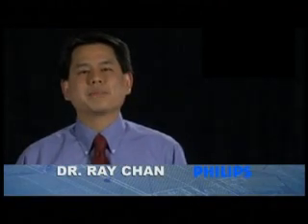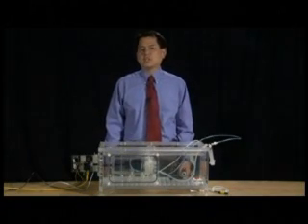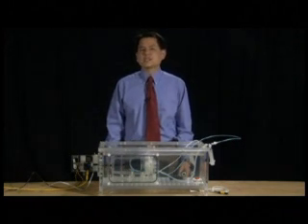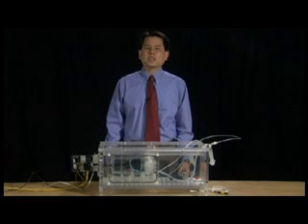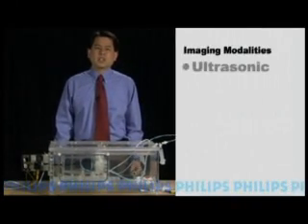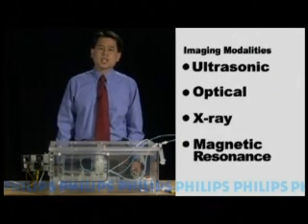I'm Dr. Ray Chan, one of the scientists at Philips Research North America. I've been working with multimodality cardiovascular imaging for over 15 years, both in academia and industry. Time and again in our research projects on the development of either new image acquisition techniques or novel processing methods, we've run into the need for versatile imaging targets that can be used reliably and reproducibly to mimic biological organ behavior under ultrasonic, optical, X-ray, and magnetic resonance-based interrogation.